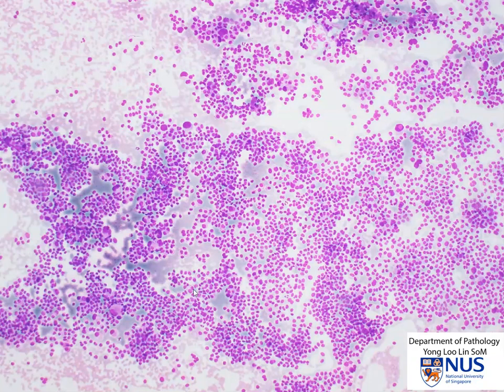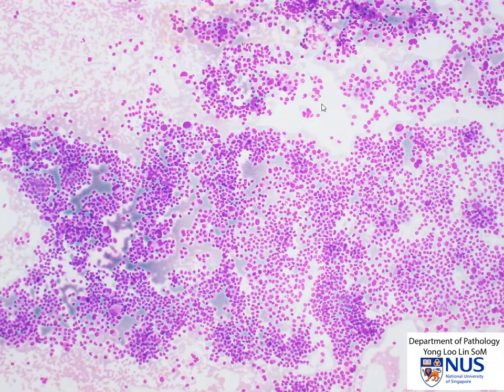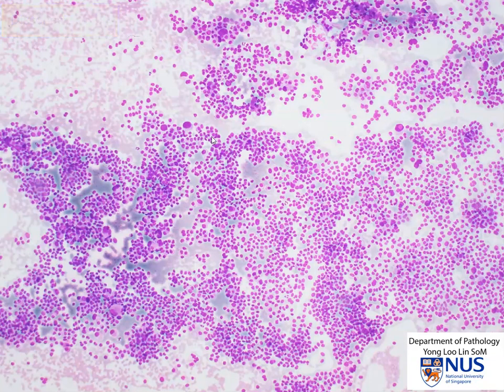Hello, this is an FNA of a thyroid nodule in a 48-year-old lady, and we can see that it is a highly cellular smear. The cells appear to be quite discohesive, or relatively loosely aggregated.